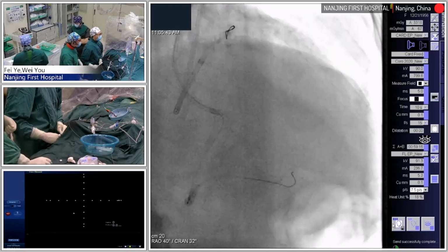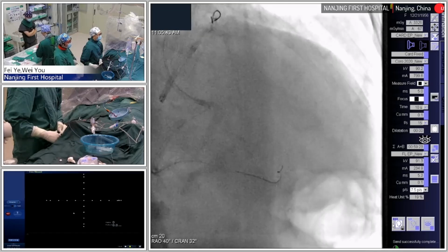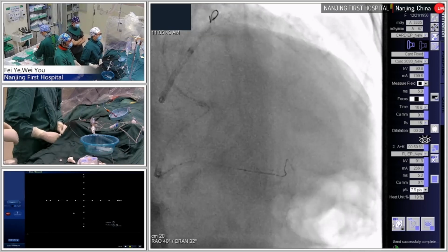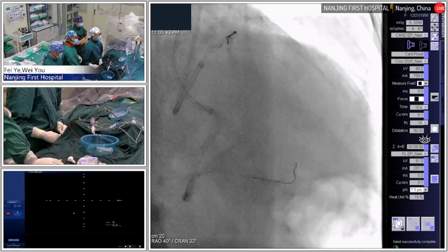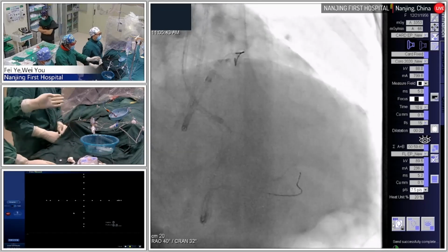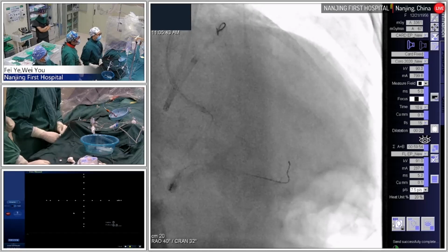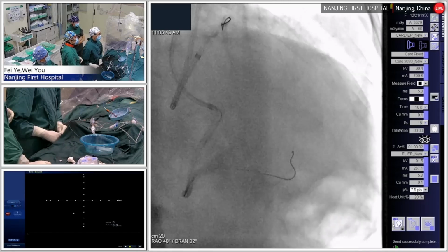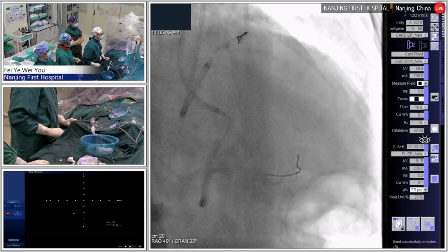Flush. Just because the case was a very tough lesion with LAD CTO lesion, we don't have any chance to perform the retrograde wire tactic from the LCA circumflex to the LAD and also from the distal RCA to the LAD. So the antegrade wire tactic is a very challenging case. I think the septal is good. Try waiting for a while. Even though we should spend a lot of time, the procedure gets longer and longer compared with the conventional PCI procedure. If we want to perform for a long time, we should pay attention to the patient's symptoms and the contrast volume, because the renal function was mildly diseased.